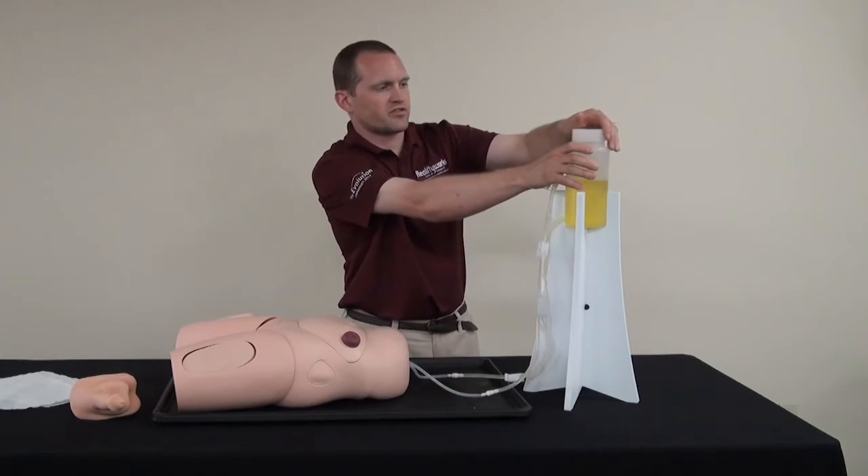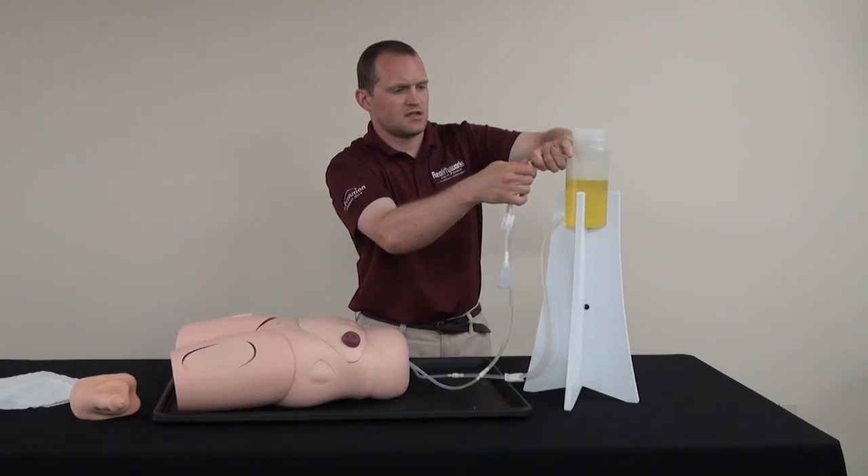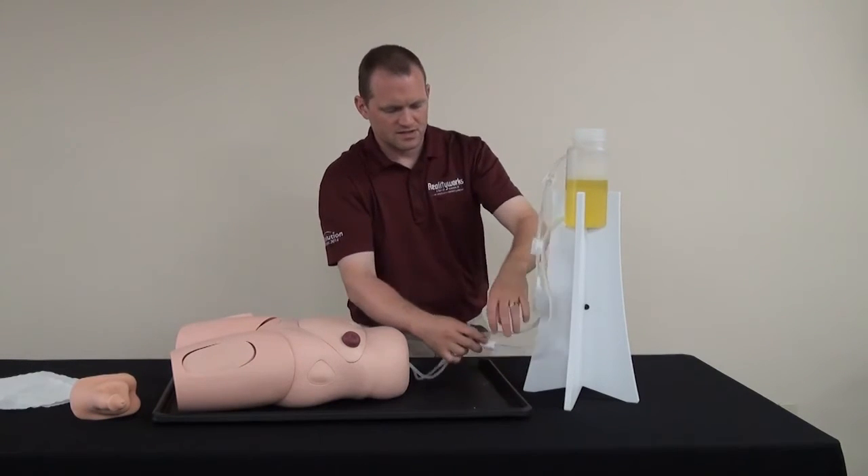Loosen the cap about three quarters of a turn, and then release the clamps.